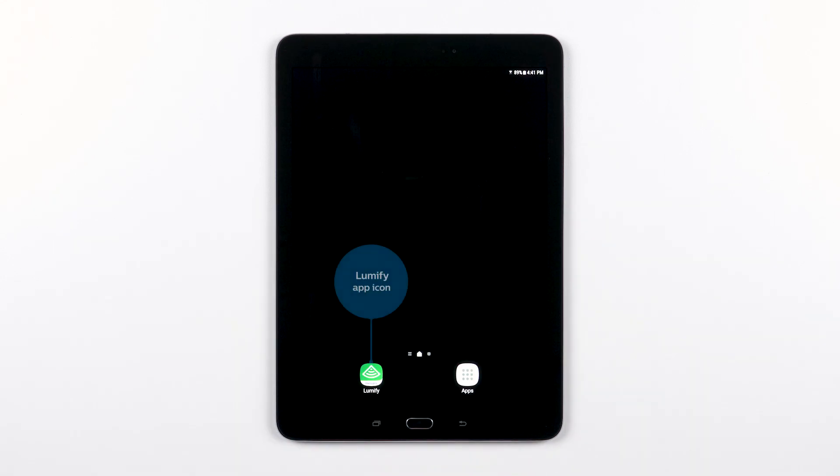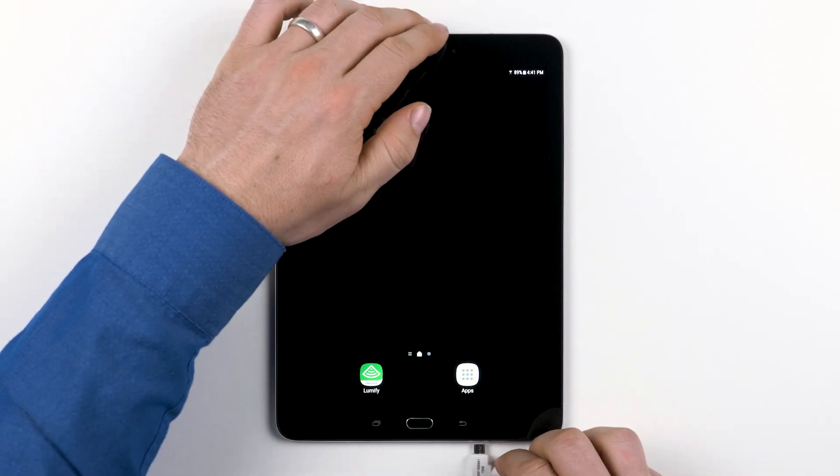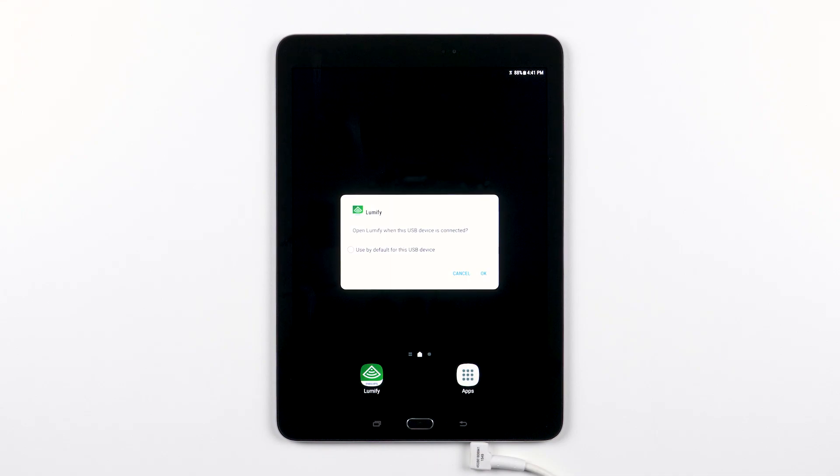Once the app is installed, you'll want to connect your Lumify transducer to your device. This will automatically open the Lumify app. You might see a dialog pop-up that says, "Open Lumify when this USB device is connected." You should check the box so this window doesn't pop up each time you plug in a transducer — "Use the default for this USB device" — and then tap OK.